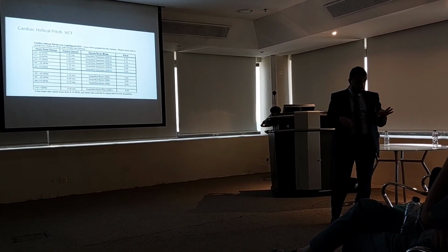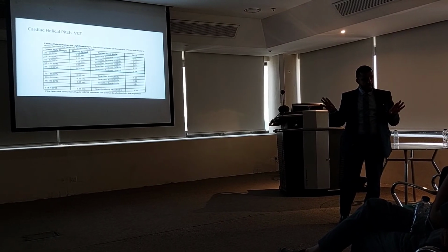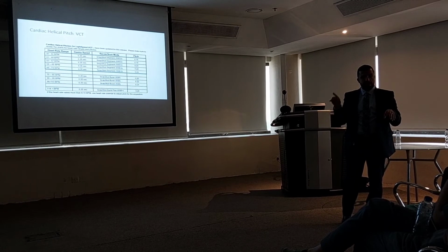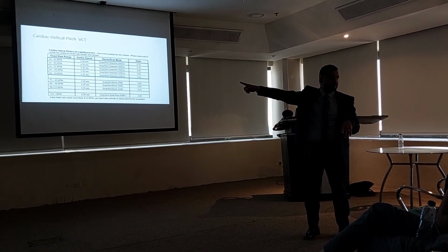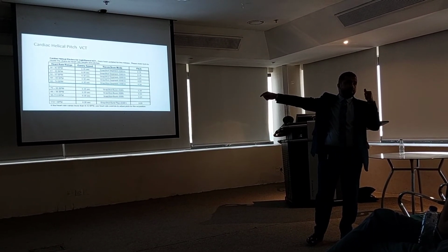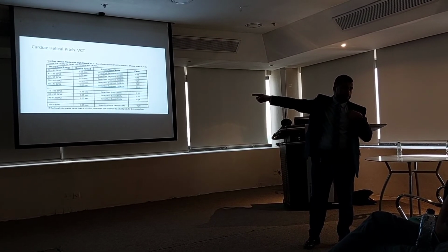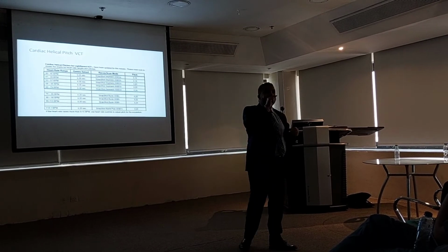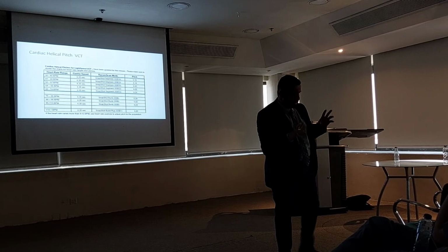It's done by the machine. It chooses, and I will tell you how. It selects the good pitch according to the beat. It will pick the proper pitch as per the heart rate of the patient. When is that? The moment I click on confirm. So this is what we have.